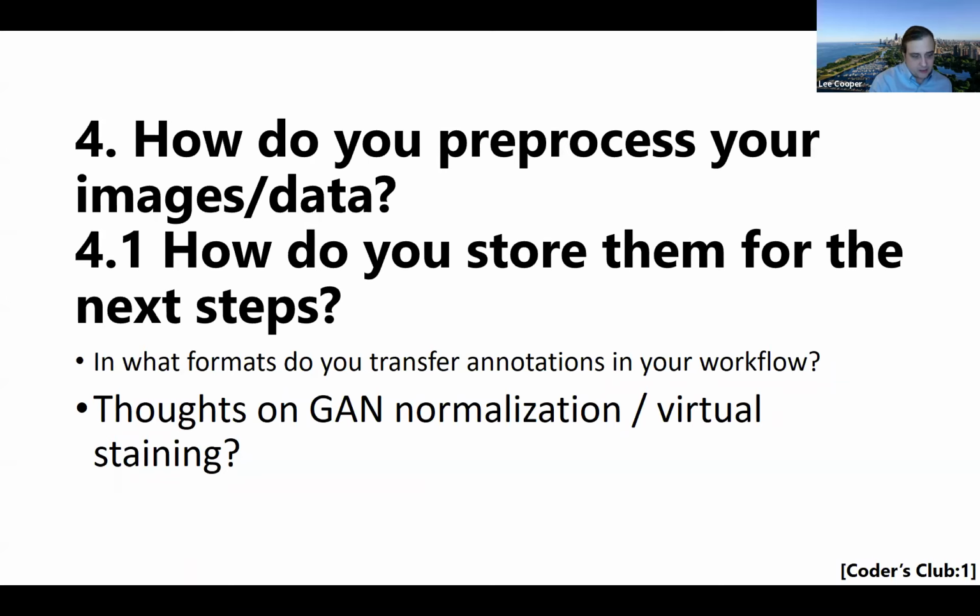So, it depends, I think, on whether you're trying to augment data for training or whether you're trying to really standardize images during inference and produce the best results there. I think that's a great point. For me, I would be very concerned about seeing an external held out data set that undergoes significant pre-processing before being exposed to inference and then claiming that model is robust. I would look at that very skeptically.